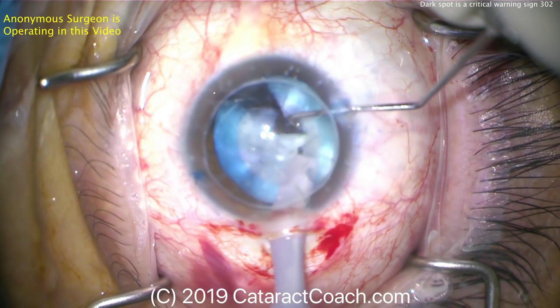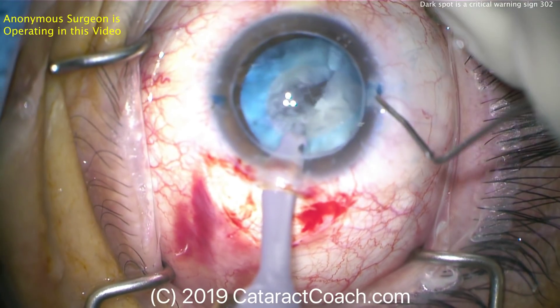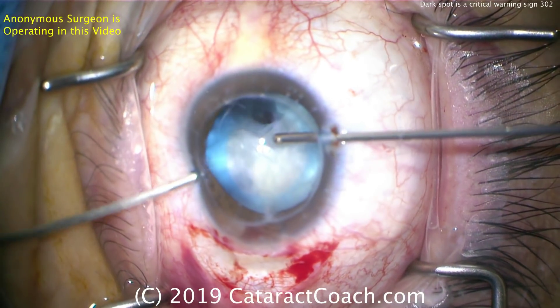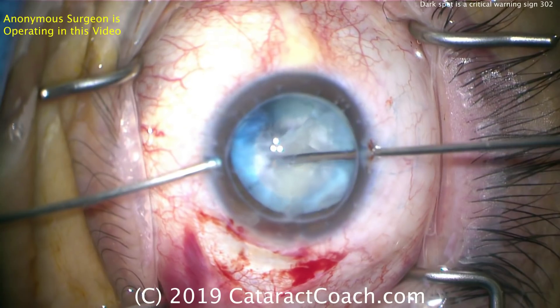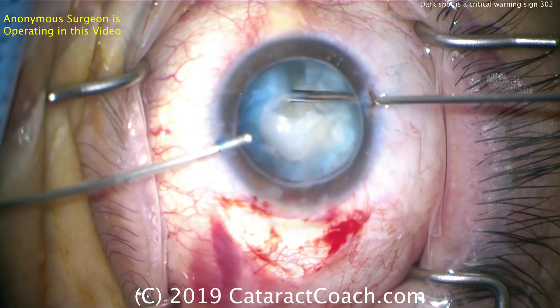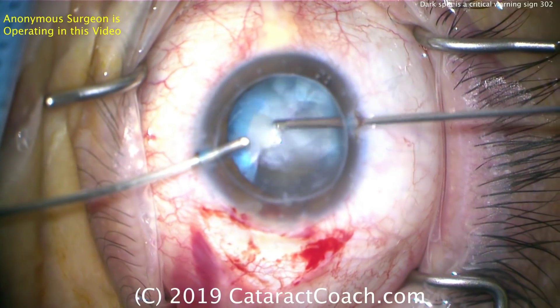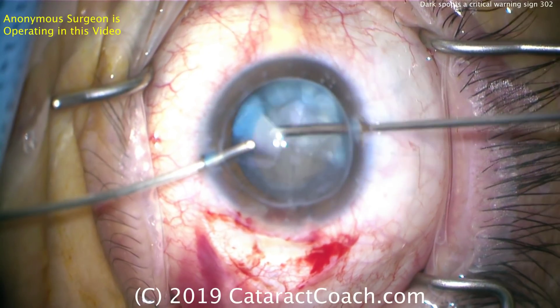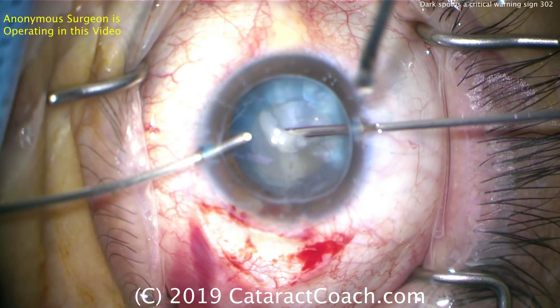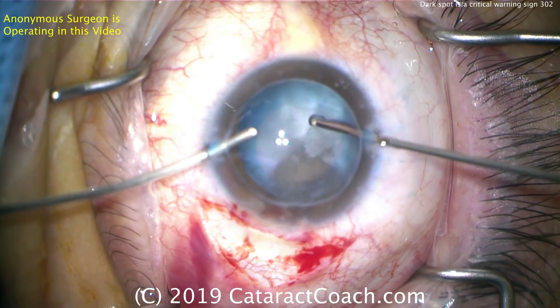At this point we really want to get the phaco probe stabilized. We want to use viscoelastic through the side port incisions. You've got to be careful — we don't want to come out of the eye, because coming out of the eye is going to cause vitreous prolapse. Now we've got the bimanual anterior vitrectomy set up, going to take out whatever material is still in the anterior segment. Undoubtedly lens material has fallen back into the vitreous cavity — that's okay. Complications do happen. This patient can have a pars plana vitrectomy, pars plana lensectomy to get that out. Do not go fishing back there trying to get these pieces from the vitreous cavity. Let it go.